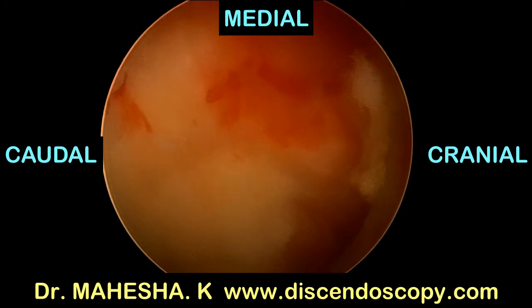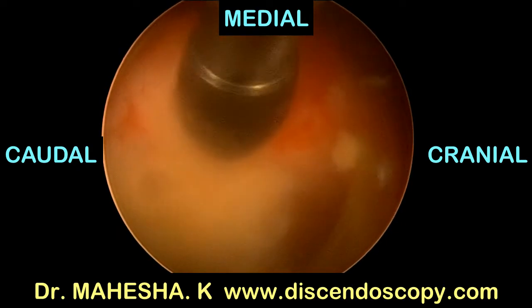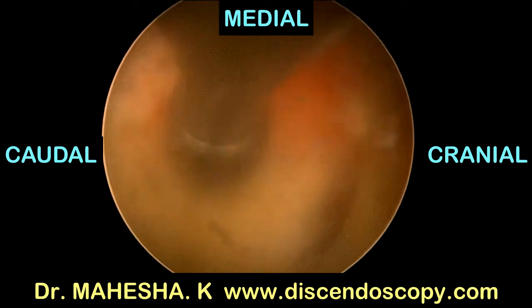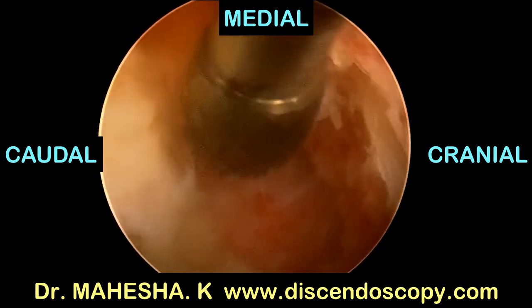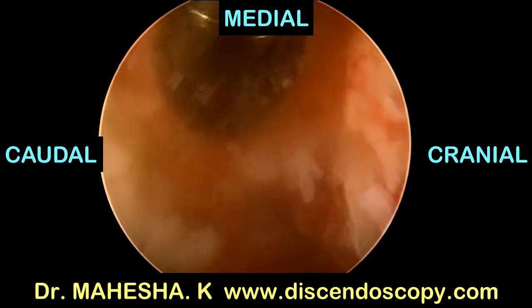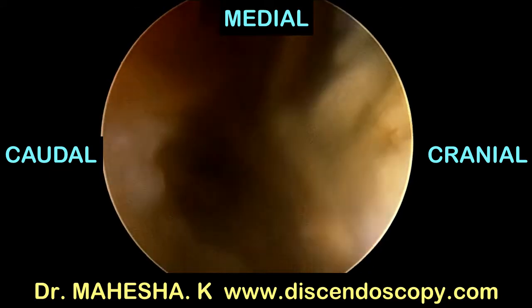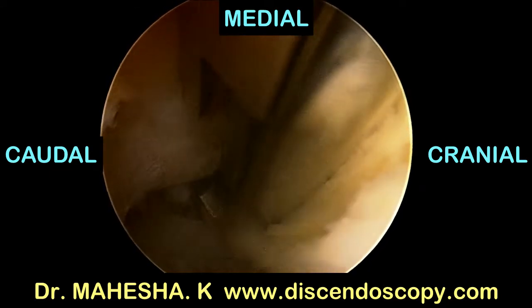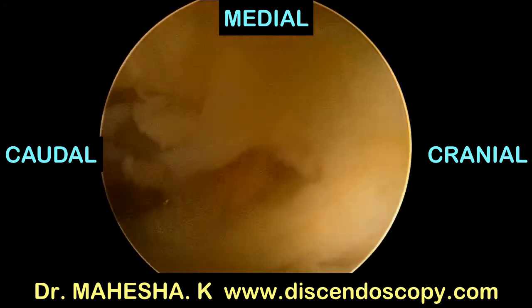Now we are exposing the base of the spinous process. The base of the spinous process is again undercut with the oval burr. This step is important so that we can go over the dura and decompress the opposite side. Now a 4 mm Kerrison is used to release the flavum from the midline.